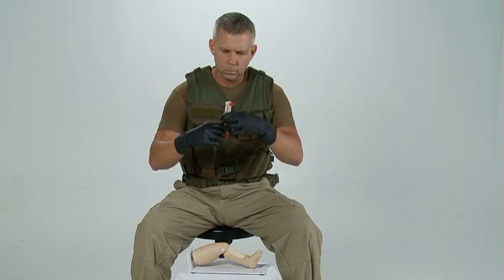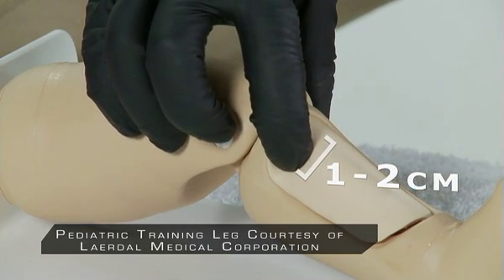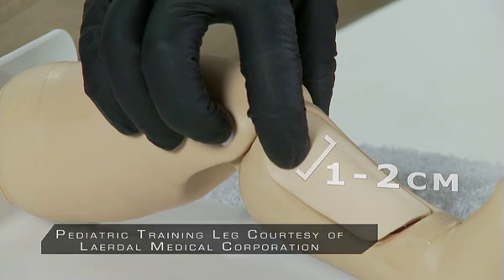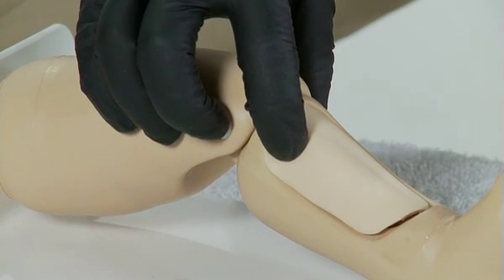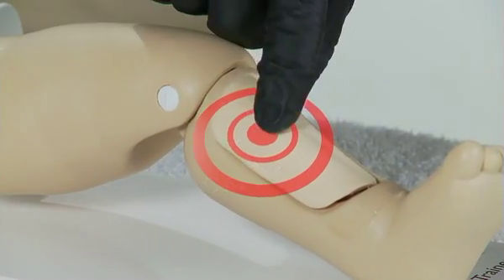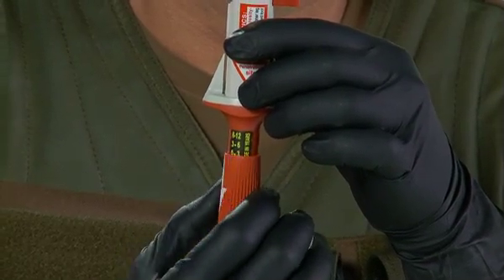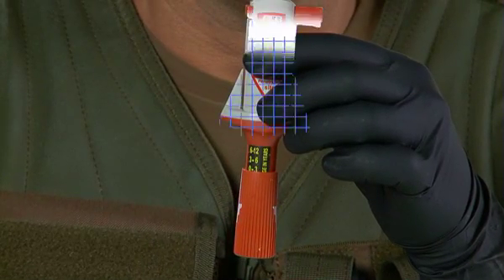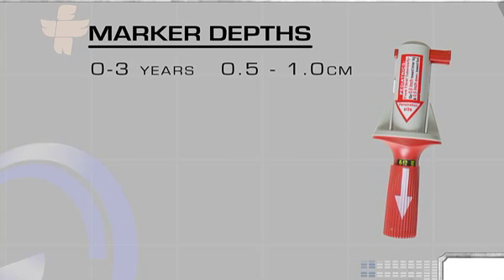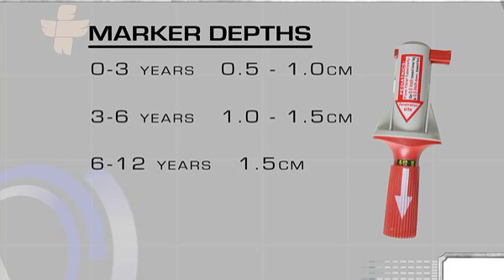For pediatric placement, find the same outset point, which is the tibial tuberosity. From the tibial tuberosity, go one to two centimeters toward the inner part of the leg to find the flat portion of bone, called the tibial plateau. From the tibial plateau, go distally, or down, toward the foot, approximately one centimeter, or half an inch. Using the red barrel, adjust the BIG's penetration depth according to the patient's age. The age and length are both marked on the device. The markers are: 0 to 3 years, 0.5 to 1 centimeter; 3 to 6 years, 1 to 1.5 centimeters; 6 to 12 years, 1.5 centimeters.